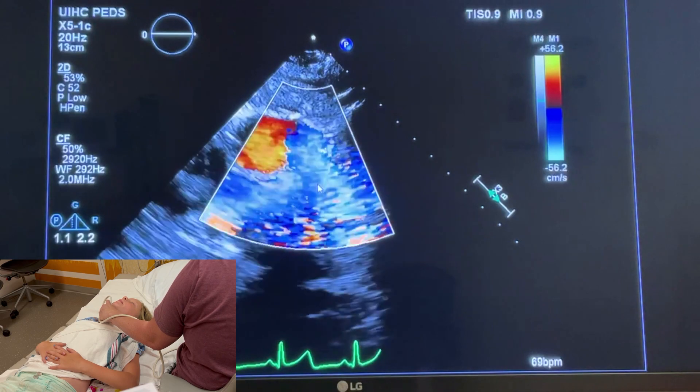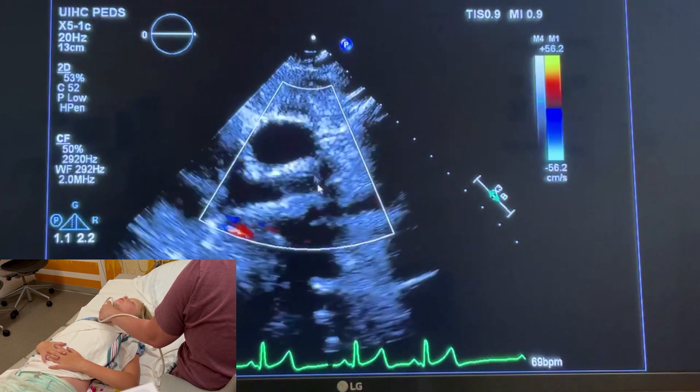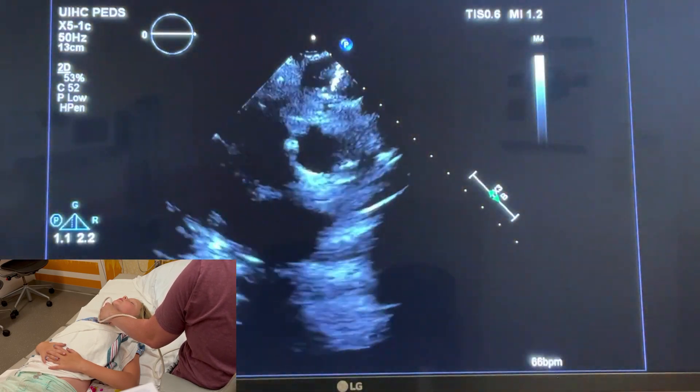Up here are your pulmonary arteries — the branch PAs, so there's RPA and LPA. You could see potentially red flow going this way — that's a PDA by the LPA. So we've assessed that.